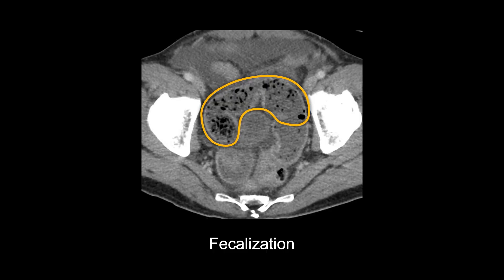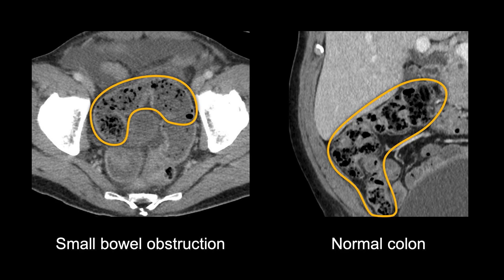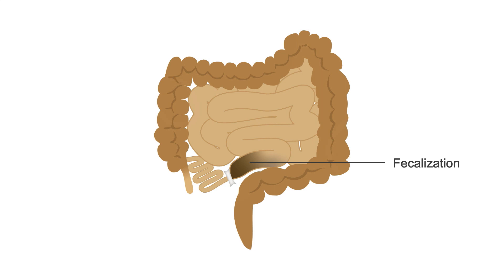The third common finding in small bowel obstruction is fecalization. This refers to the contents of the small bowel taking on the appearance of stool, or feces, characterized by little black dots of air. Normally, the contents of the small bowel are fluid-like, with feces only arising in the colon. Fecalization normally occurs right before the transition point, and thus can help direct you to the cause of obstruction.